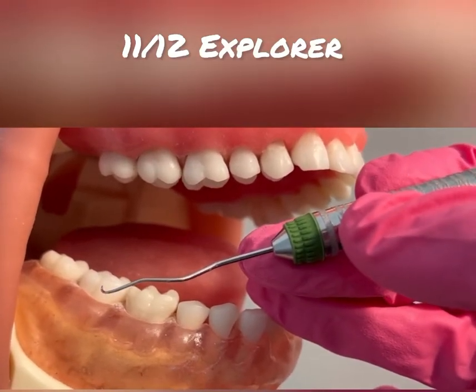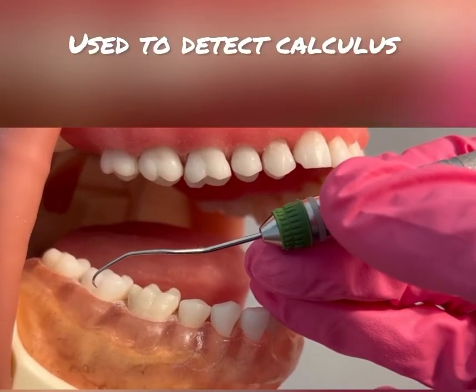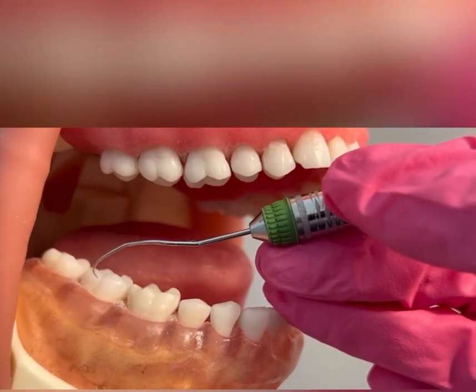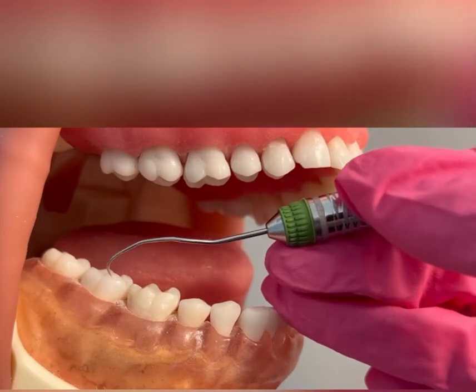Introducing the 11-12 Explorer. This instrument is an assessment instrument used to detect supra and subgingival calculus. I will be demonstrating on teeth numbers 31, 30, and 29, which are on the lower right quadrant.